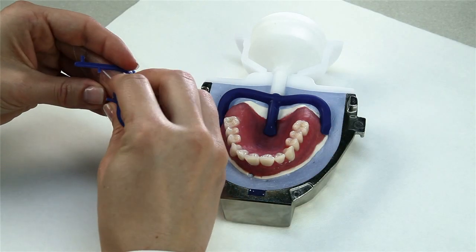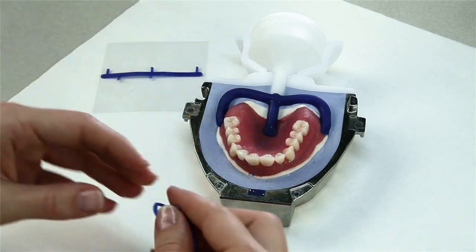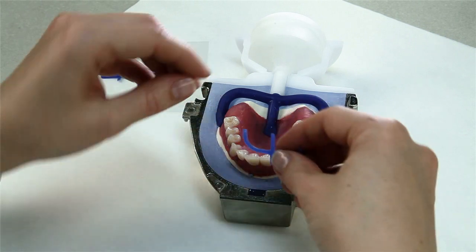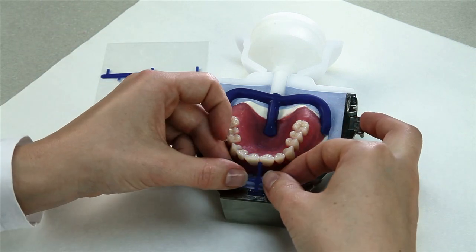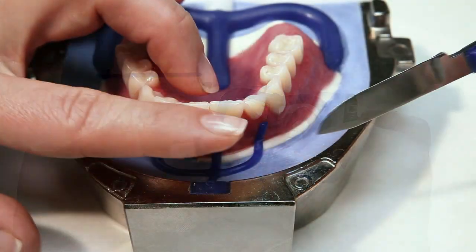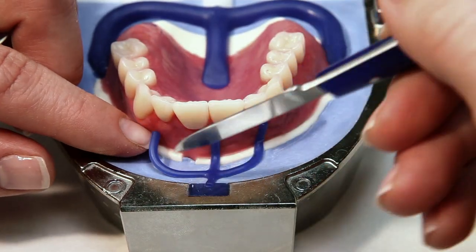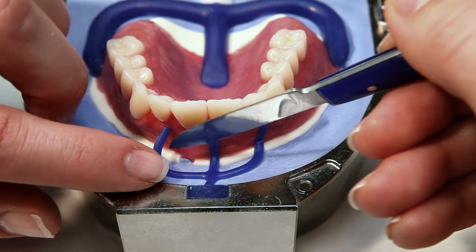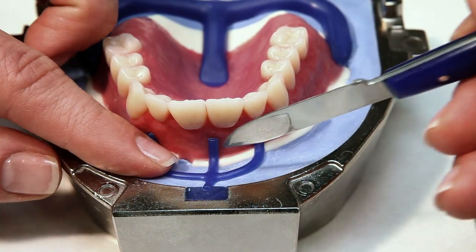In order to aerate the hollow space of the flask during injection, attach an aeration channel in the anterior region of all restorations. Place the complete wax components in such a way that there is a connection between the wax-up and the filter wax component.